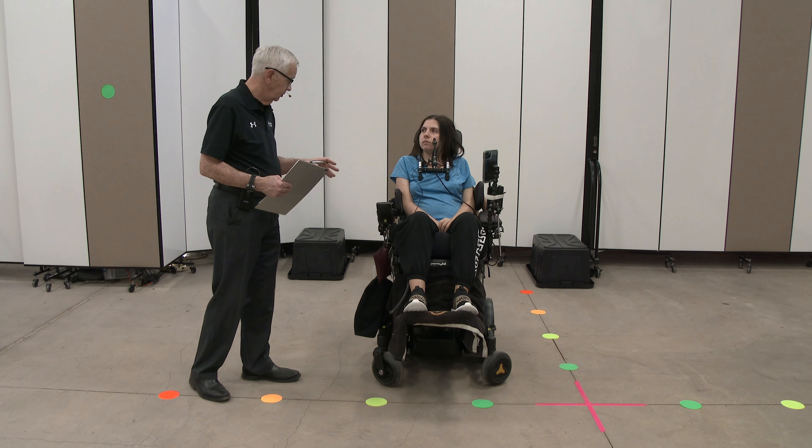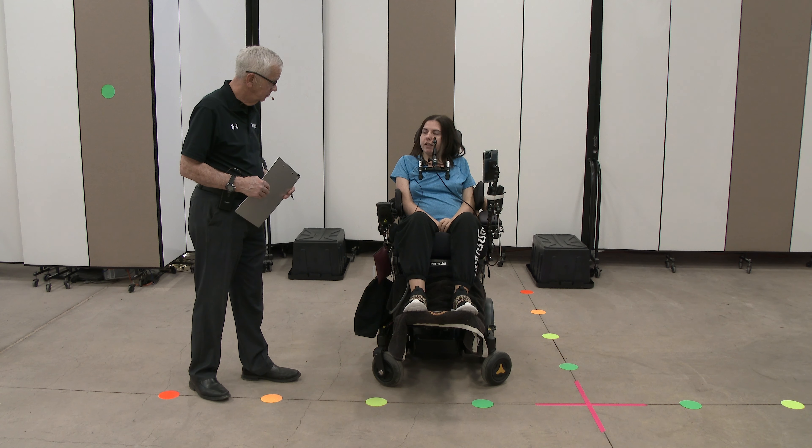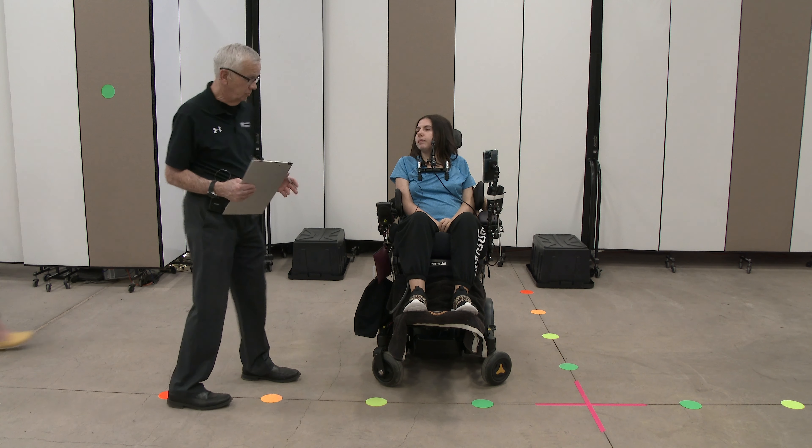As far as program modes in your chair, are you able to control the changing of those? I can't, but I can instruct someone. Okay, perhaps you could do so.